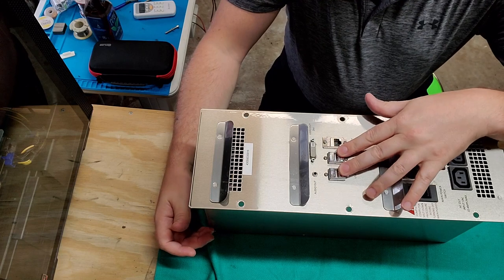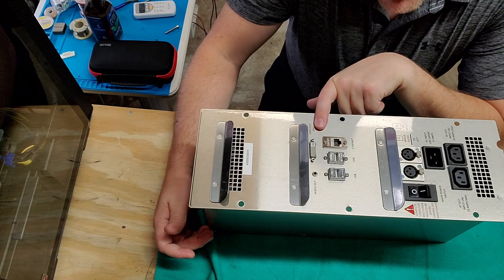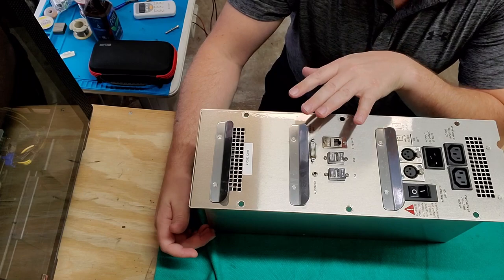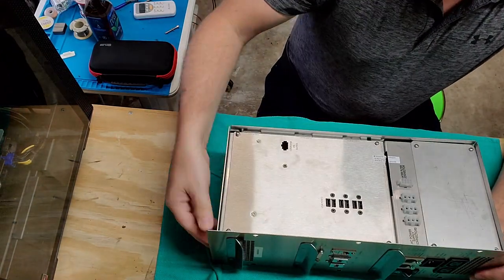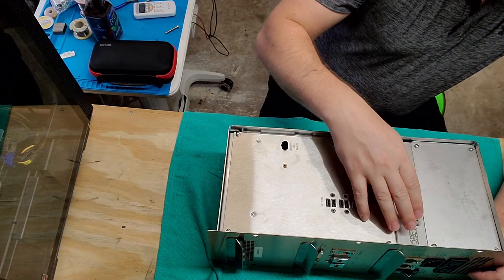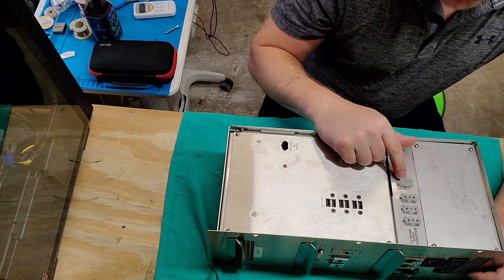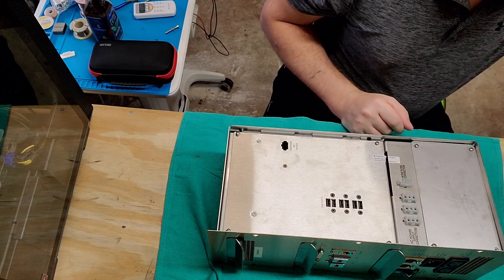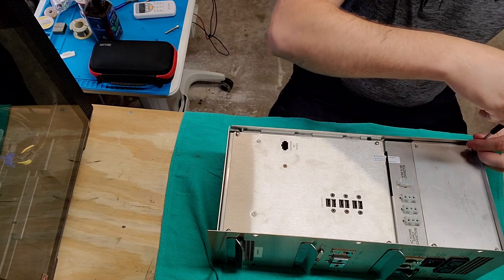But it's got two USB 2.0s. I have a DVI video output. Very curious, because this is a very unusual layout for a motherboard if the motherboard's laying up against it. And here you can see I've got six USB 2.0s and some AC supply connectors and water filter, probably DC connector. We're gonna figure that out, guys, because I do not know what is behind these panels. So let's check it out.